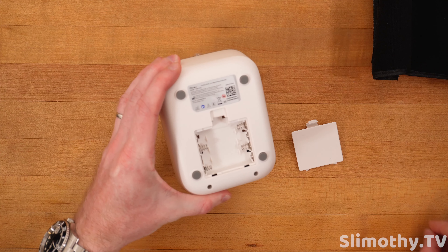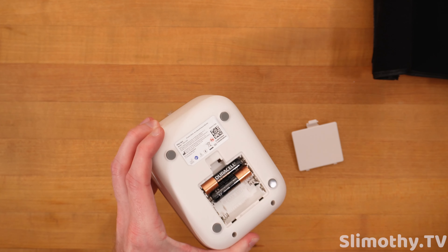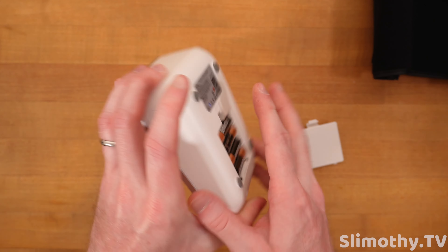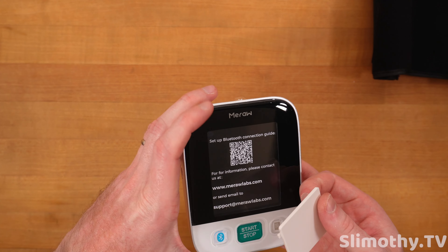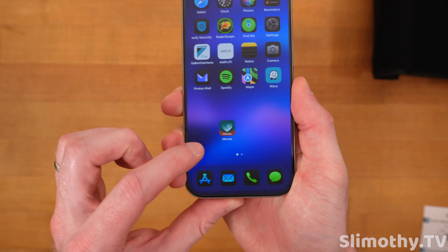Let's go ahead and install these batteries right away — one, two, three, four, just like that. It does boot up right away, which is cool.